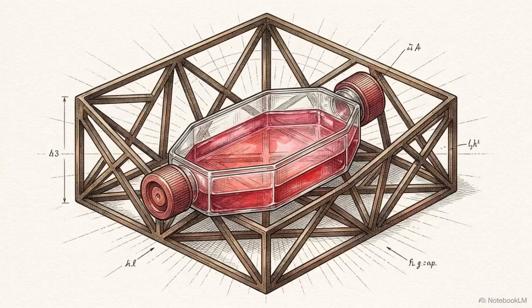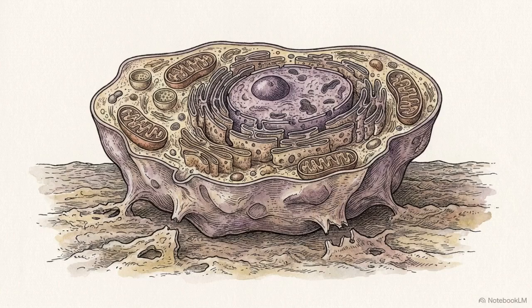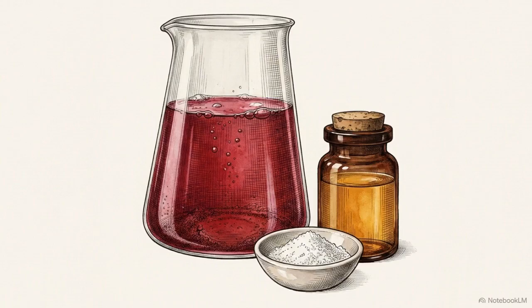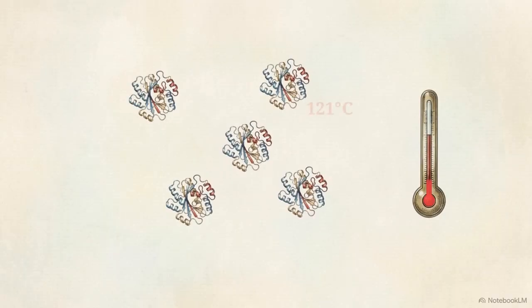This complexity reaches its peak in mammalian cell culture. At this level, simple salts, sugars, and yeast extracts are no longer sufficient to keep isolated cells alive in a flask. To sustain these cells, researchers must mimic the complex in vivo environment of a living animal by adding undefined biological growth factors. A standard mammalian media, like DMEM, requires the inclusion of fetal bovine serum and precise pH buffers, like sodium bicarbonate. This shift creates a logistical challenge.